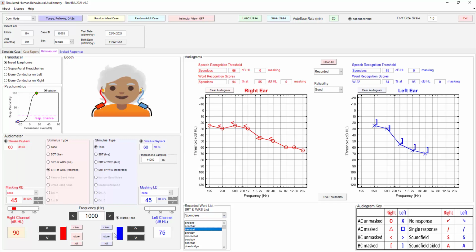So we'll just go ahead and keep on that same. Baseball. And she responds baseball. And again, you can raise or lower the stimuli until detection. Baseball. Is really not heard. Baleful. And gets it incorrect. Okay, so that demonstrates the different stimulus types we can present to the patient.